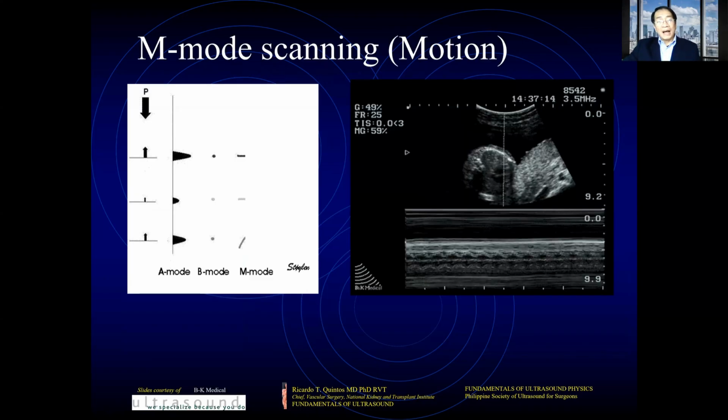All right. Now, the M mode is also a combination of the A mode and the B mode, except there is now the dimension of time.